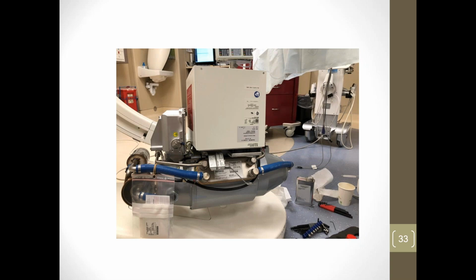So kind of a little trick that they were able to add on some of the earlier systems. They didn't have this, and the images were really jittery, like those old films where they're kind of choppy and bouncing all around. Well, that's how the early cath lab images were, until they figured out how to synchronize the X-ray tube with the camera, or detector in this case.